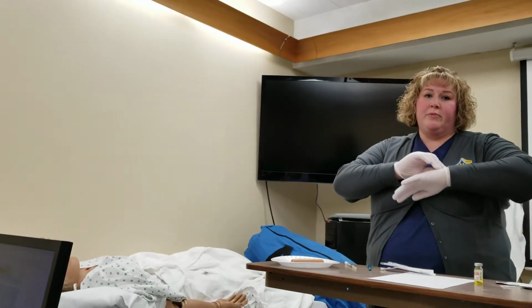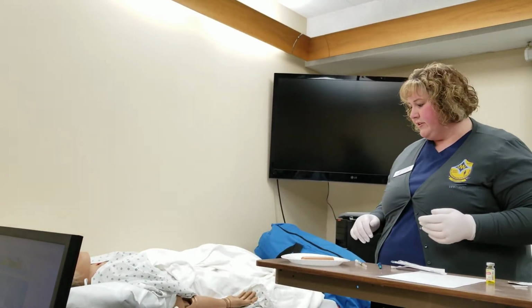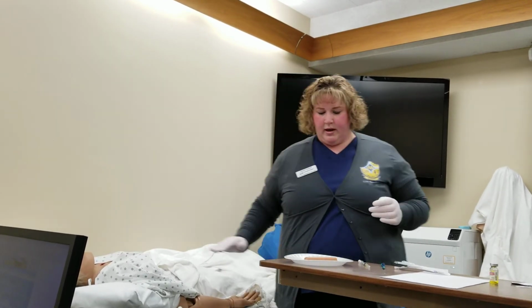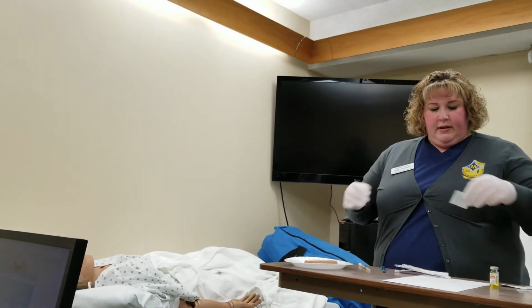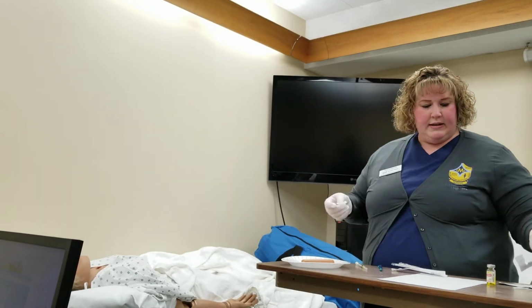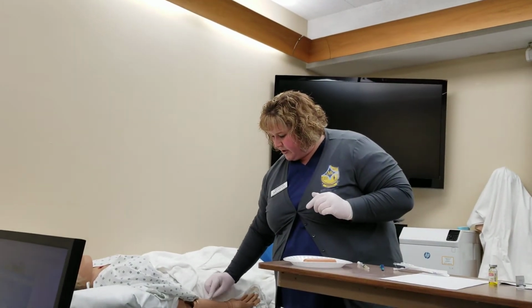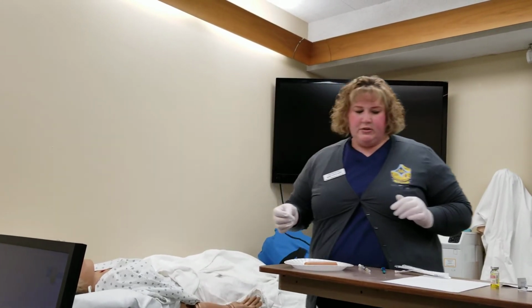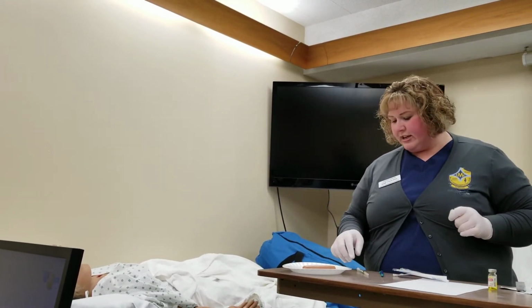Now for an intradermal injection, you can use 3 spots. You can use the anterior forearm, the upper chest, or the upper back. I am going to use the anterior forearm. So the first thing I'm going to do is clean the area from the center out in a circular motion, making sure not to touch a cleaned area twice. And we're going to let that dry completely before giving the injection.